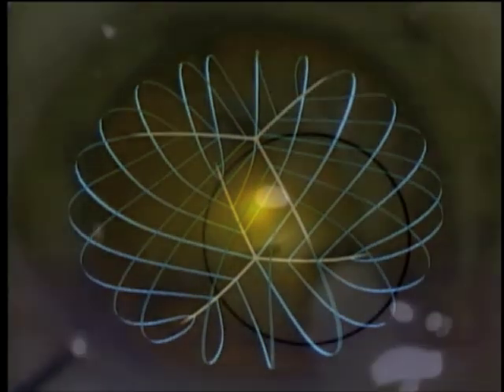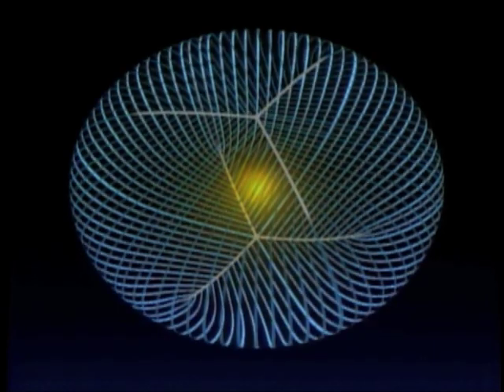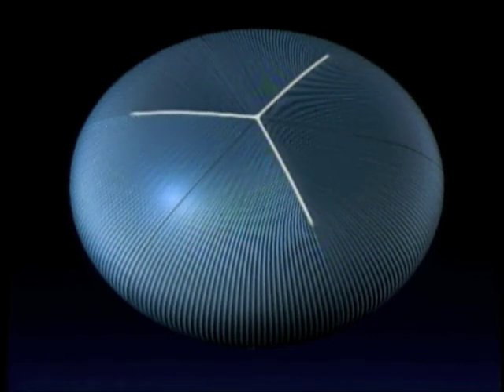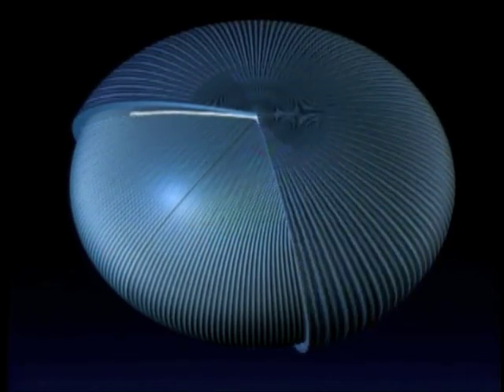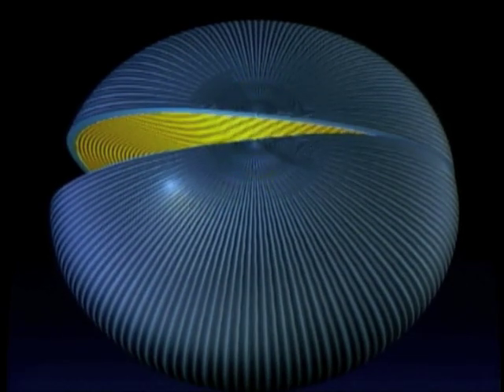Here the Y-suture is demonstrated during sculpting through the nucleus of this cataract. There are natural fault lines in the lens corresponding to these radial fibers that are laid down throughout life. The lens develops in layers, the last of which is cortex, but orientation of the lens fibers also creates radial cleavage planes through which cracks can be made.